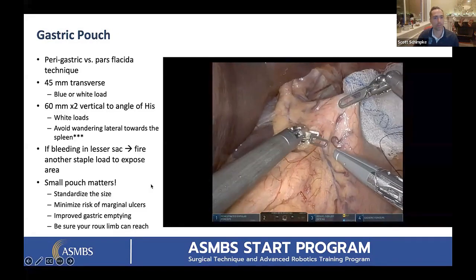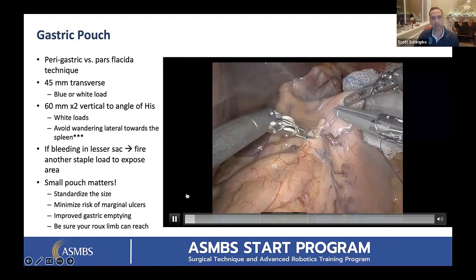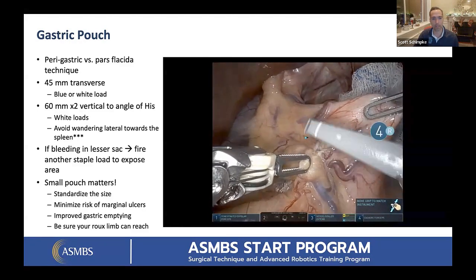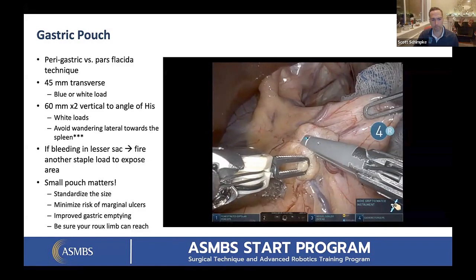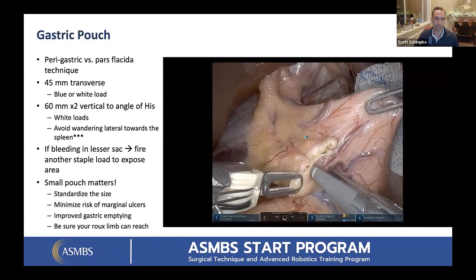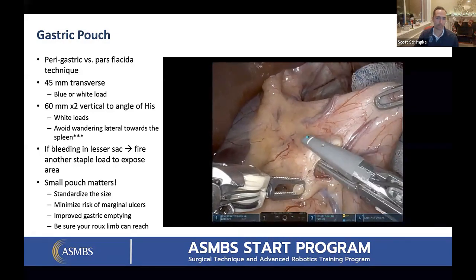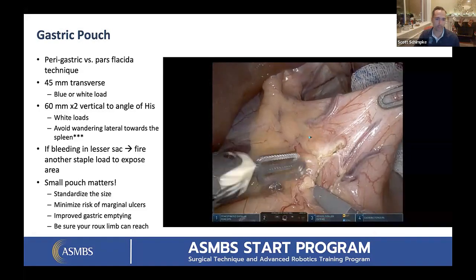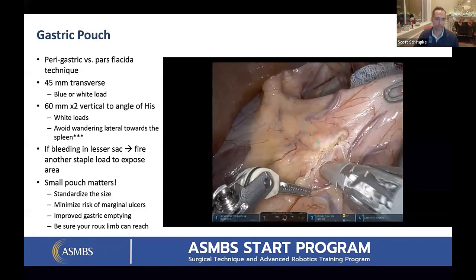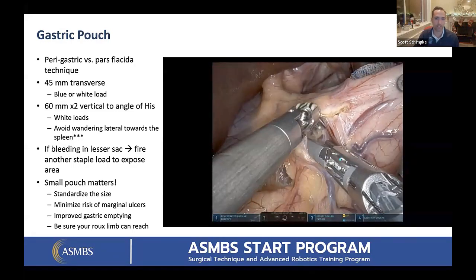My apologies, I forgot to start the video at the most obvious part here. So this is the perigastric technique, vessel sealer in my right hand. I should say the fellow's right hand, but in our right hand, and then in the left hand, I use a bipolar, although I'm infamous for stepping on the bipolar pedal by accident. So I actually never turn on the bipolar per se, unless I actually need it. That way I don't accidentally buzz something in my left hand that I don't intend on buzzing.